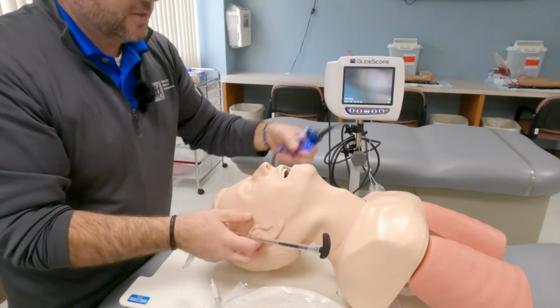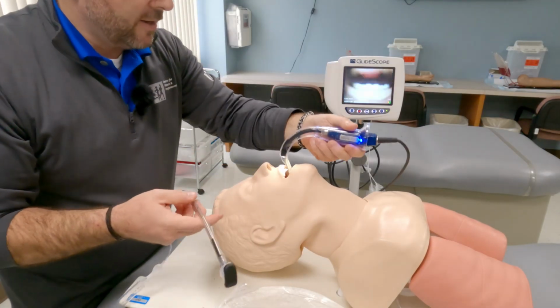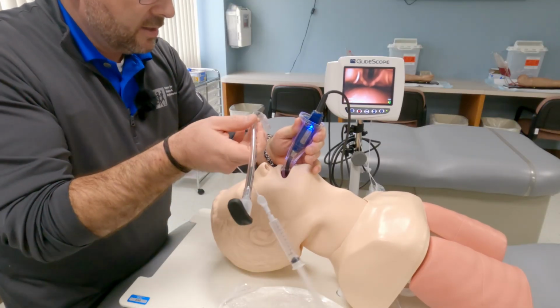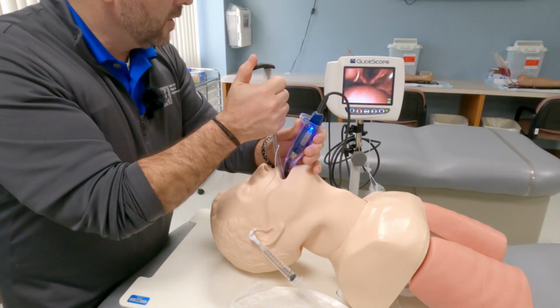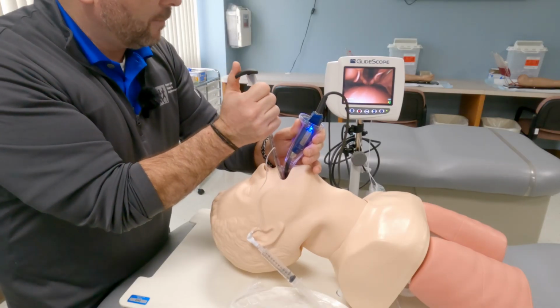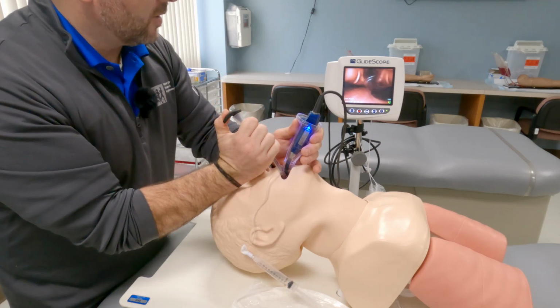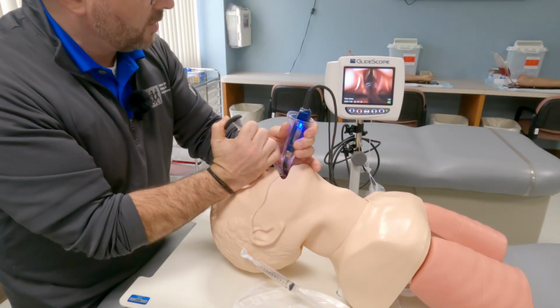So let's start from the beginning again. Straight down the center. Visualize. I see it. Next one in, 90-degree angle, around the corner. Go up to the joystick. Oh, I'm on the side. I'm going to push to my right and then insert. And you can see it's starting to go in the cord. It's going to the right spot.